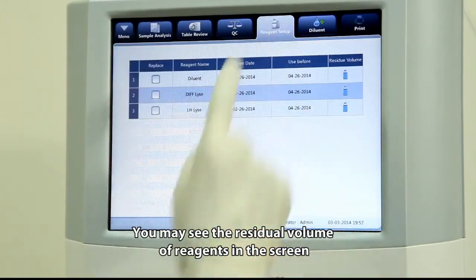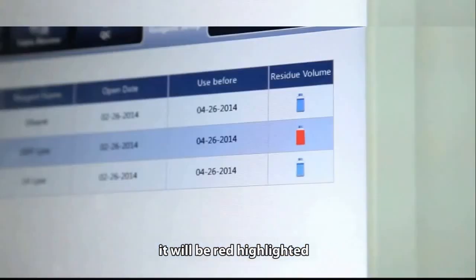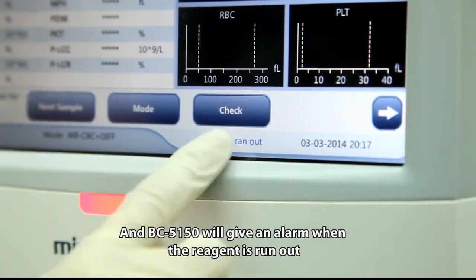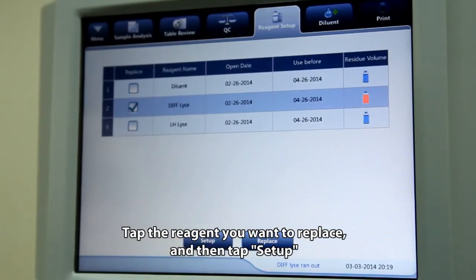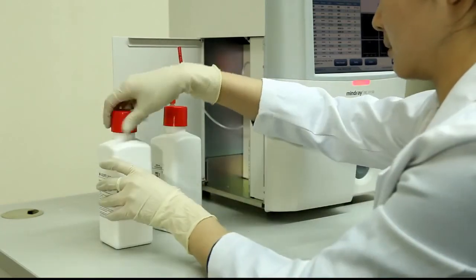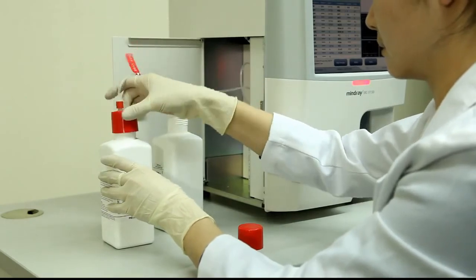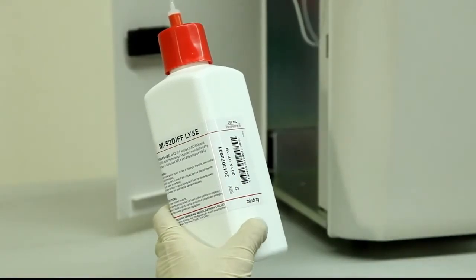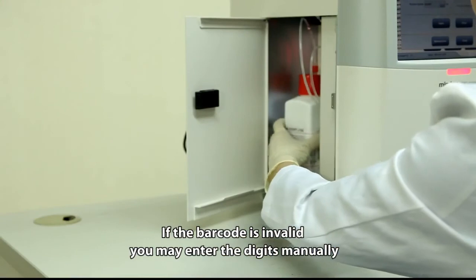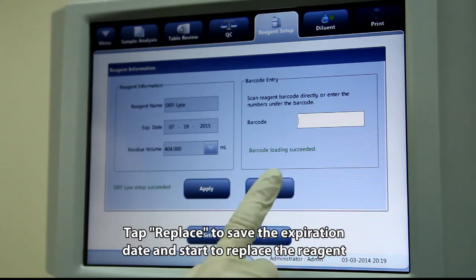You can view the residual volume of reagents on screen. When the residual reagent volume is near the end, it will be highlighted in red and BC5150 will give an alarm when the reagent runs out. Tap the reagent you want to replace and then tap setup. If the barcode is invalid, you may enter the digits manually. Tap replace to save the expiration date and start replacing the reagent.